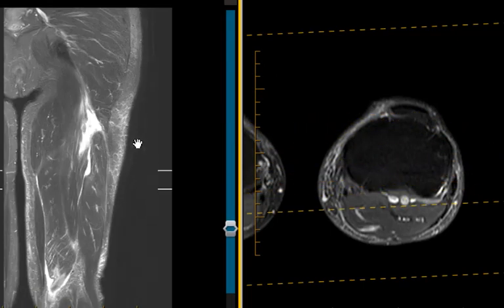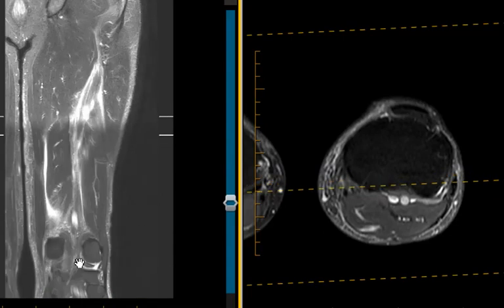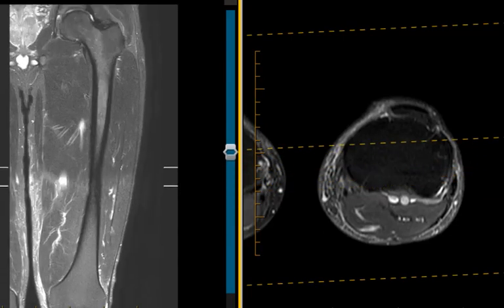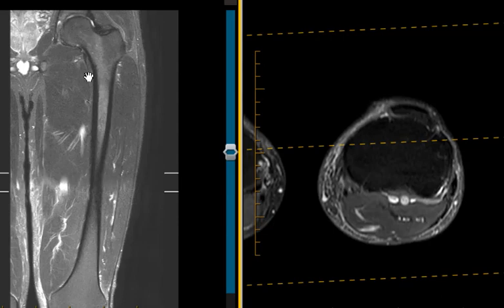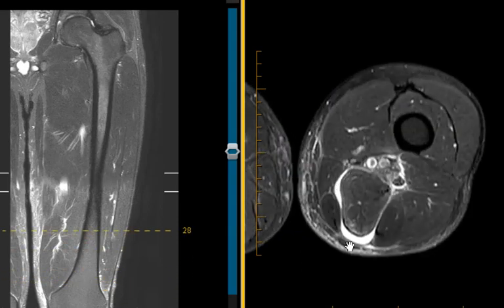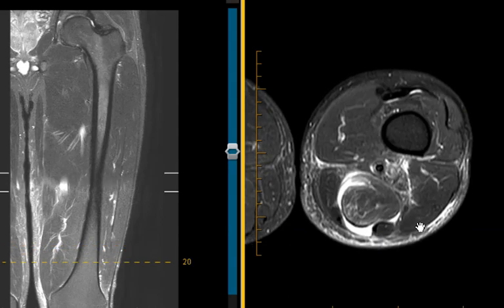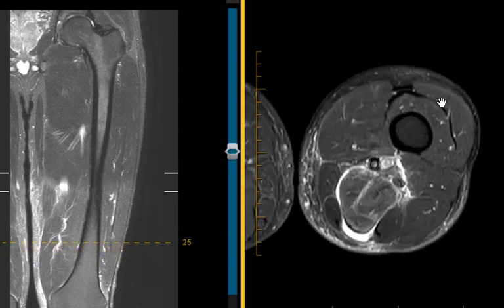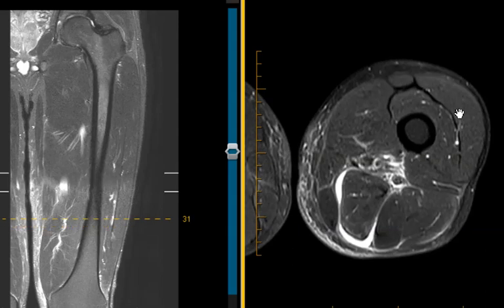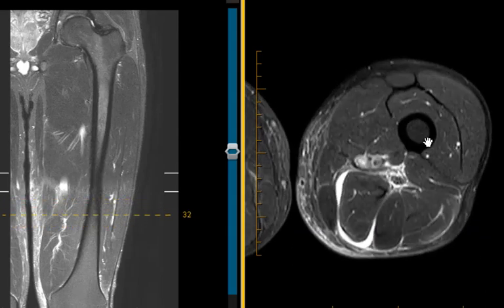This is a view of the thigh. This is called a coronal image, where the top is here and the bottom is here. We can see the knee joint down below, and if we slide the patient down, this is the hip up here, so we see the whole thigh. This is called an axial view, where we're slicing in short axis. We can see the back of the muscles here — that brightness is where there's tearing of the hamstring muscles. The muscles up front, the quadriceps muscles, look nice and dark and uniform. This is the bone, the femur.